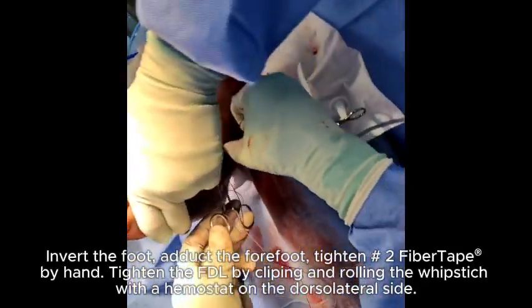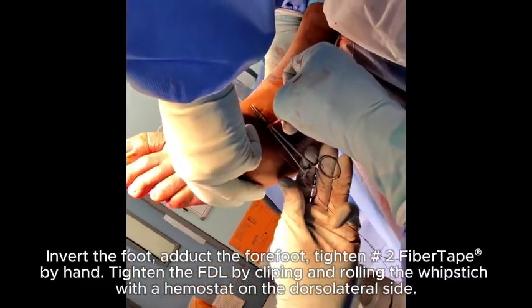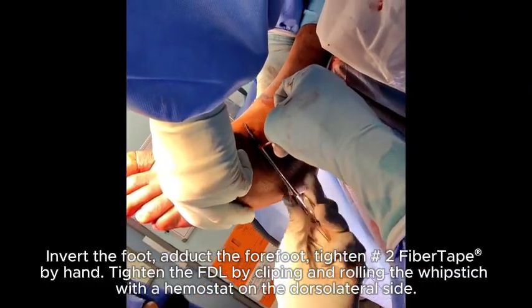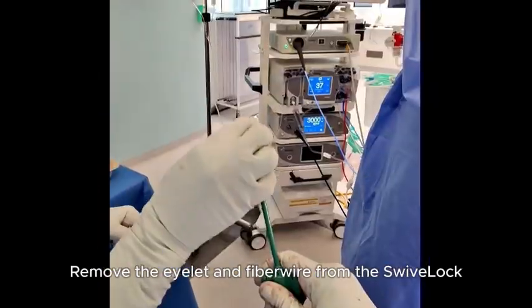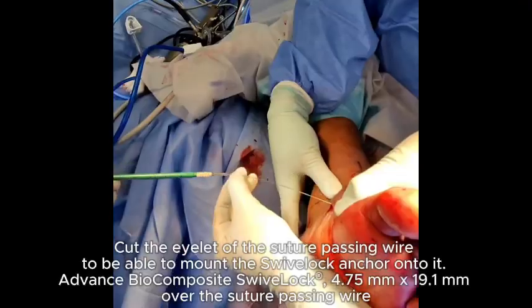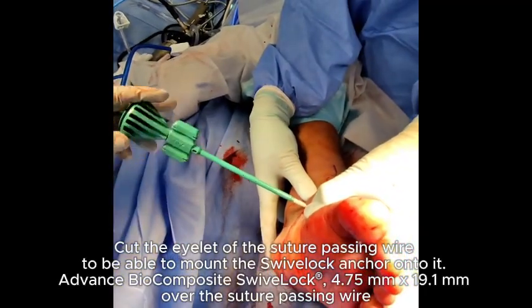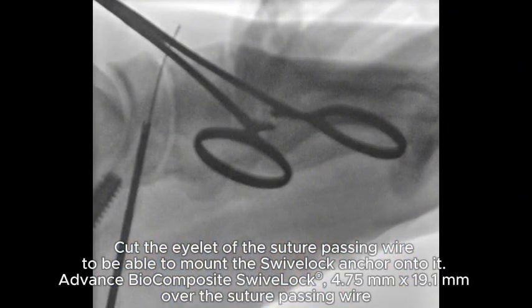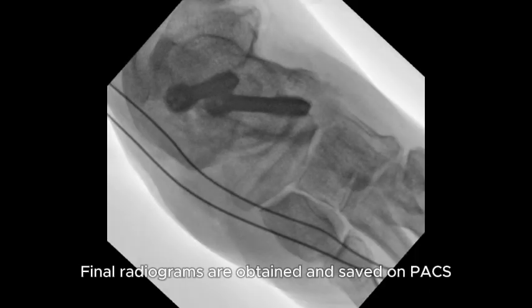Invert the foot, adduct the forefoot, tighten number 2 fiber tape by hand, tighten the FDL by clipping and rolling the whip stitch with the hemostat on the dorsolateral side. Remove the eyelet and the fiber wire from the swivel lock. Cut the eyelet off the suture passing wire to be able to mount a swivel lock anchor onto it. Advance a composite swivel lock 4.75 by 19.1 mm over the wire. Final radiograms are obtained and saved on PACS.